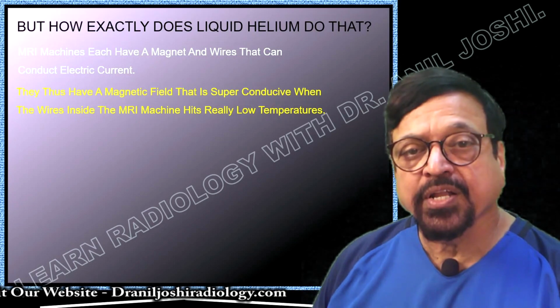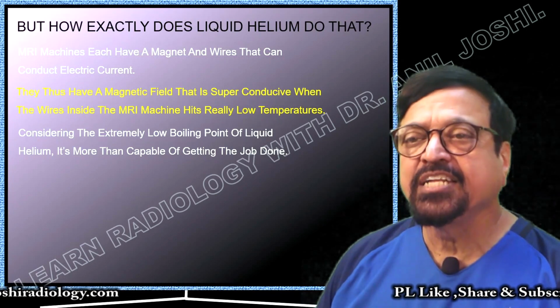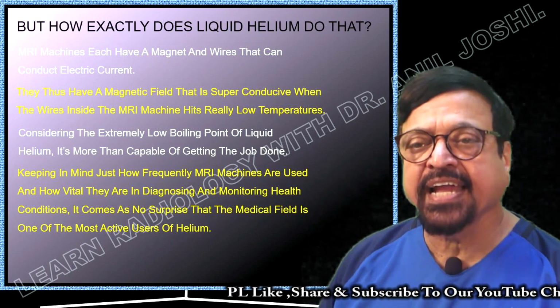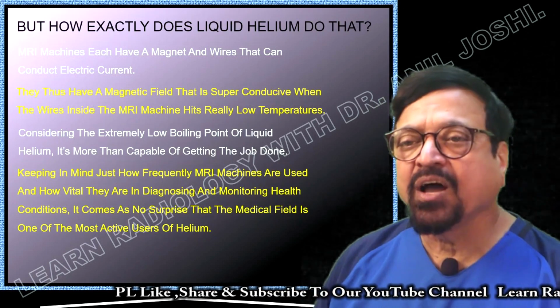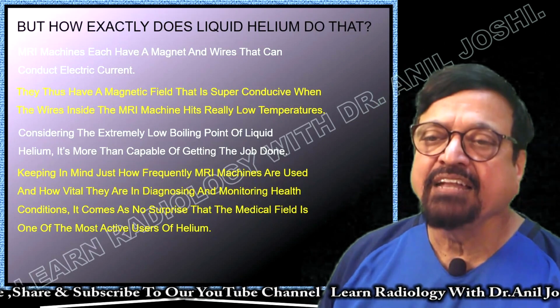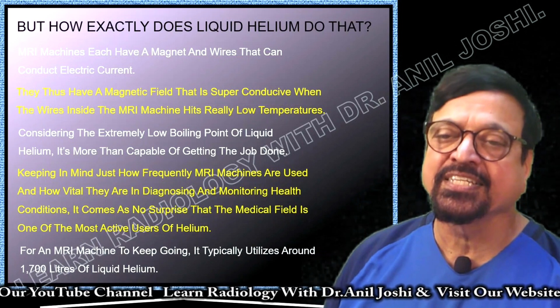So they become superconductive when they reach a lower temperature, which is minus 269. Considering the extremely low boiling point of helium, it is most capable of getting the job done, which we need to put the wires into the superconducting stage by taking them to minus 269 degrees. Keeping in mind just how frequently MRI machines are used and how vital they are in diagnosis and monitoring of health conditions, the medical field is one of the most important consumers, and helium is most required in the medical industry.